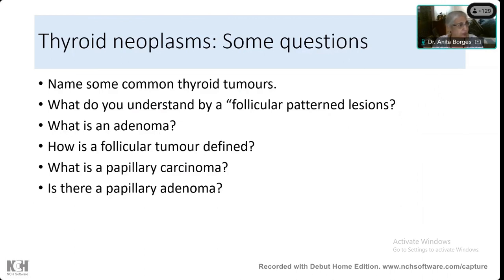Now suppose I ask you, Deepak, there are follicles in the lymph node, yes? Is that a follicular pattern? No, ma'am. So you don't have a follicular pattern in a lymph node? Actually, in thyroid, yes, but in lymph node the presence of follicles is also there. So then what is a follicle, Deepak? Follicle means cells are arranged in a ring-like fashion. But they are not arranged in a ring-like fashion in a lymph node, are they? They are filled up with cells.